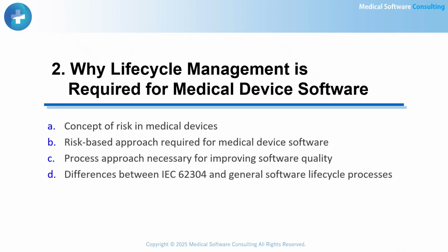In this section, we will explore why lifecycle management is required for medical device software. First, we need to understand the concept of risk in medical devices. Unlike general software, failures in medical device software can directly impact patient safety. Second, a risk-based approach is essential. This means that we must identify potential risks, evaluate their impact on patients, and implement controls to reduce those risks. Third, we need a strong process approach. Consistent processes are not just about compliance, they are the foundation for improving software quality and ensuring reliable performance over time.